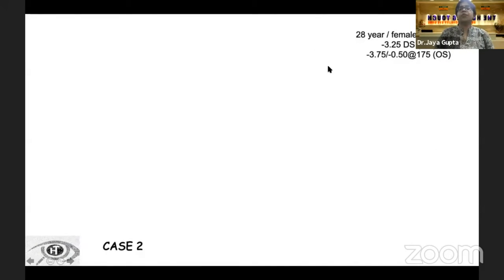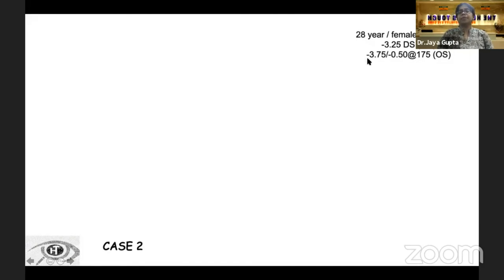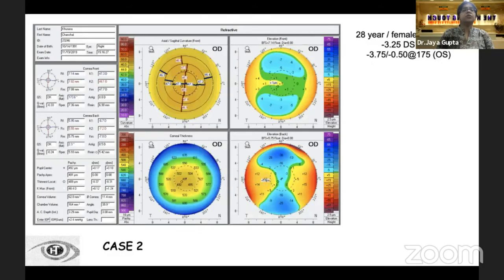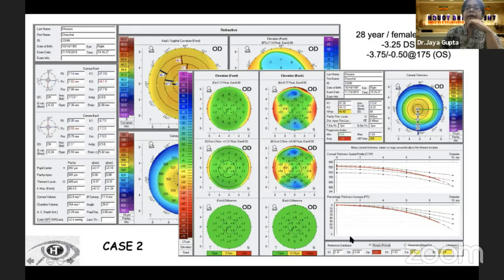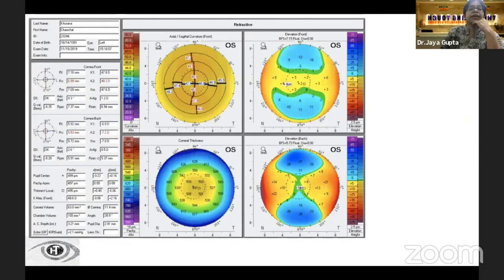Case 2: a 28-year-old female with a very normal refraction of minus 3.25 in the right eye and minus 3.75 with minus 0.5 cylinder in the left eye. On the Belin-Ambrósio display, suspect findings include the progression index, the ART max value, the graph tipping down, and suspect D values. In this case, we would recommend waiting.